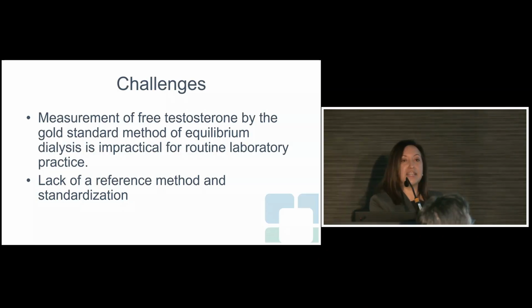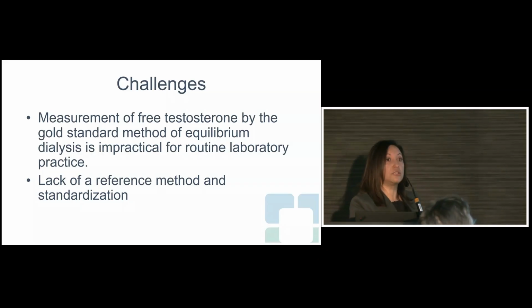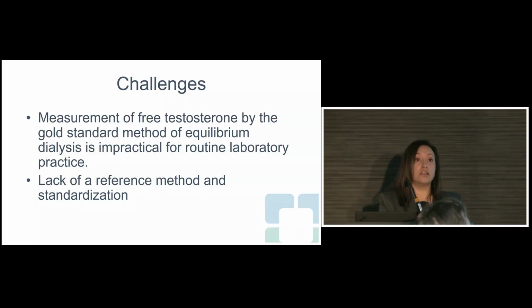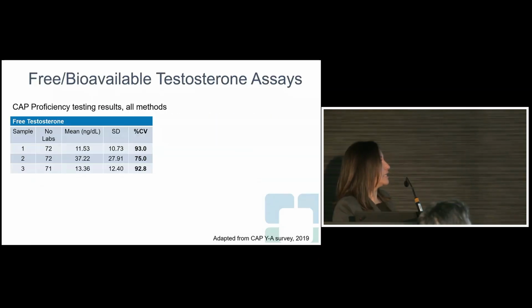We can recognize that equilibrium dialysis is the gold standard. That is great, but that comes with a lot of analytical challenges. We can also recognize that calculations are more practical, but there's also no consensus about what represents an accurate measurement or an accurate calculation or estimation due to the lack of a reference method and standardization of these assays.